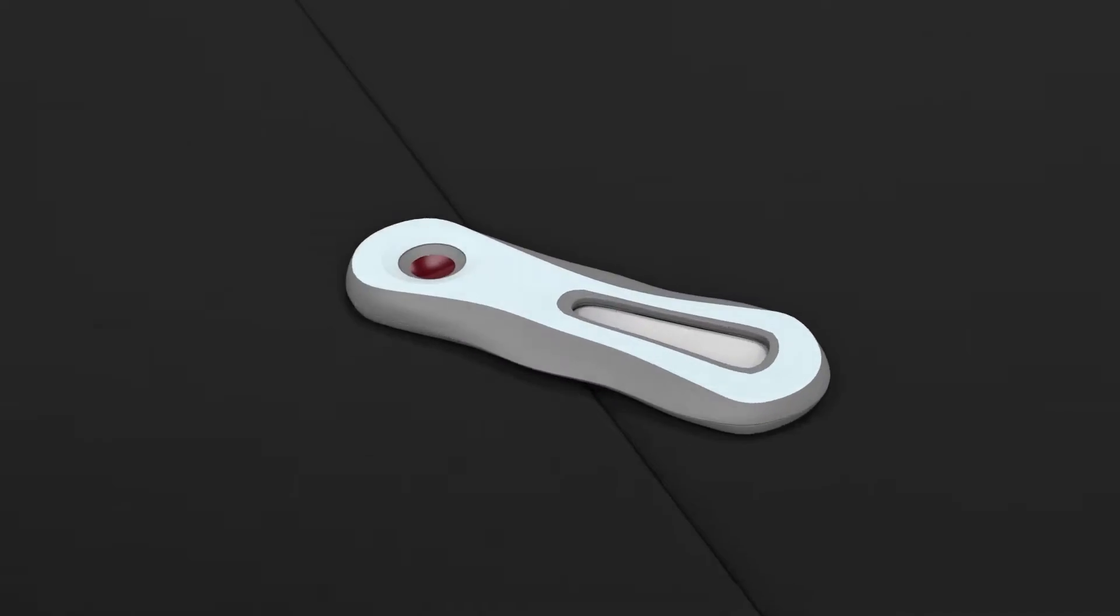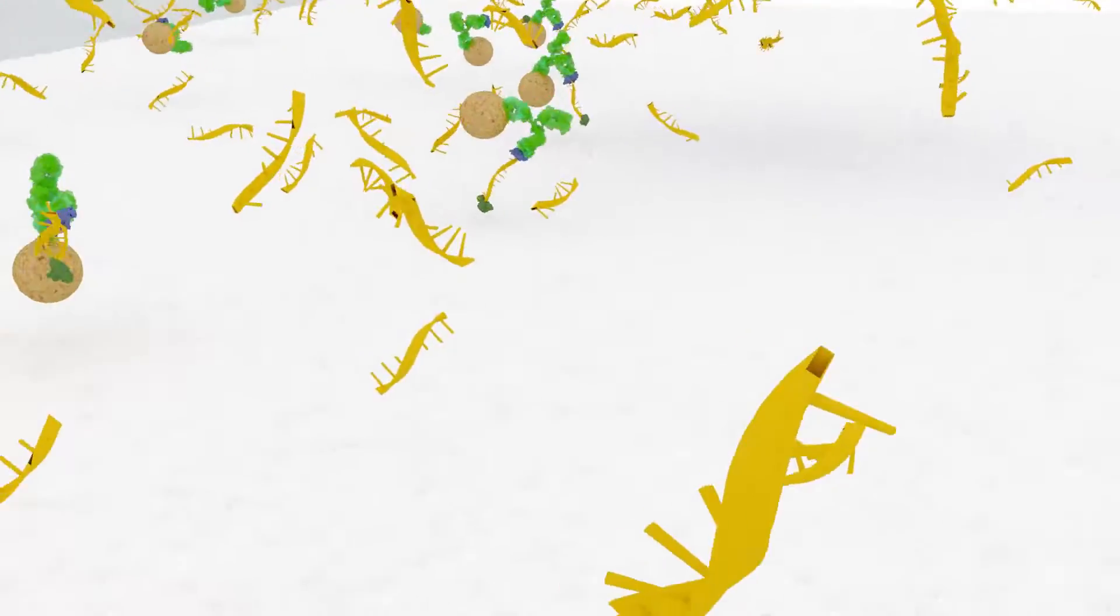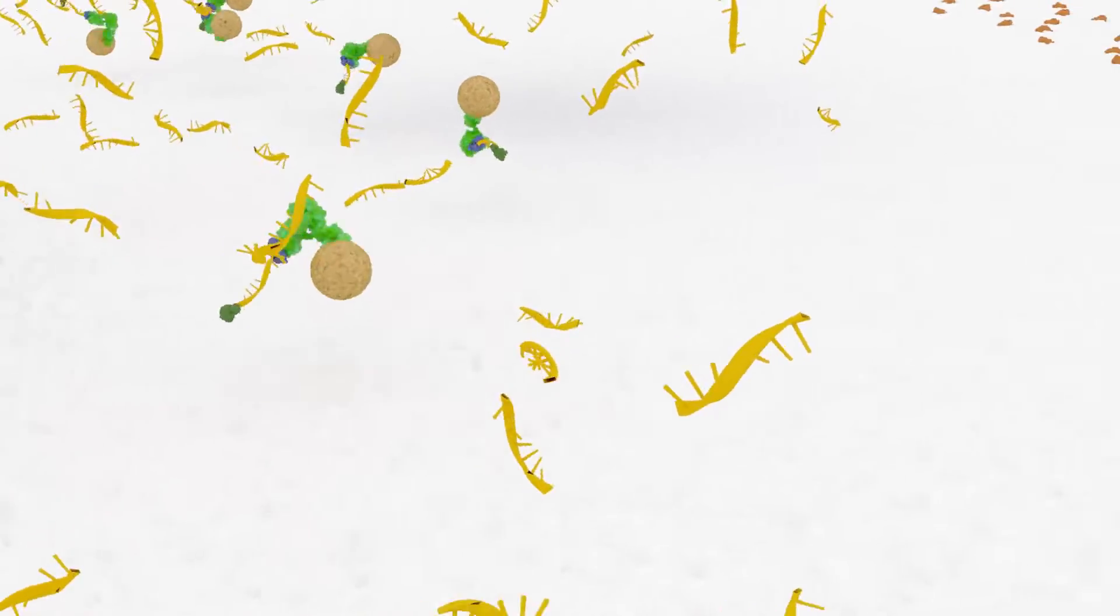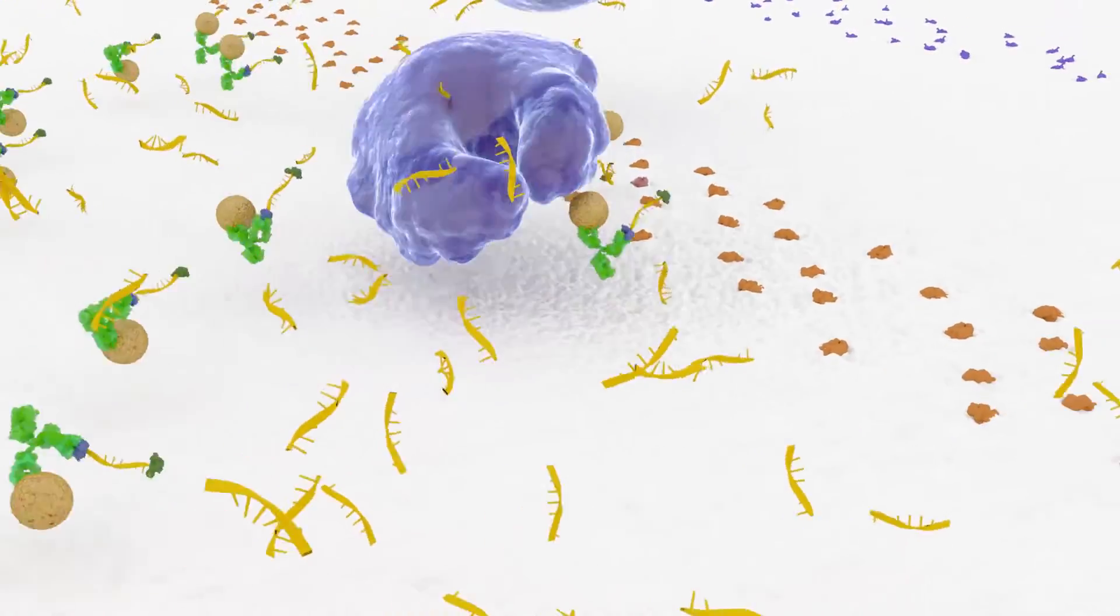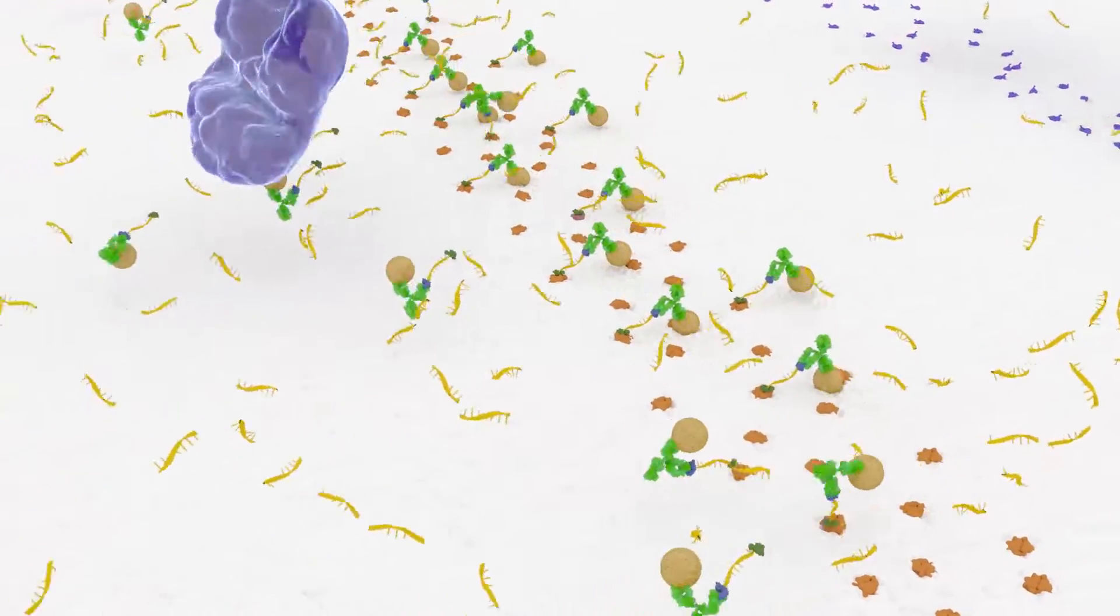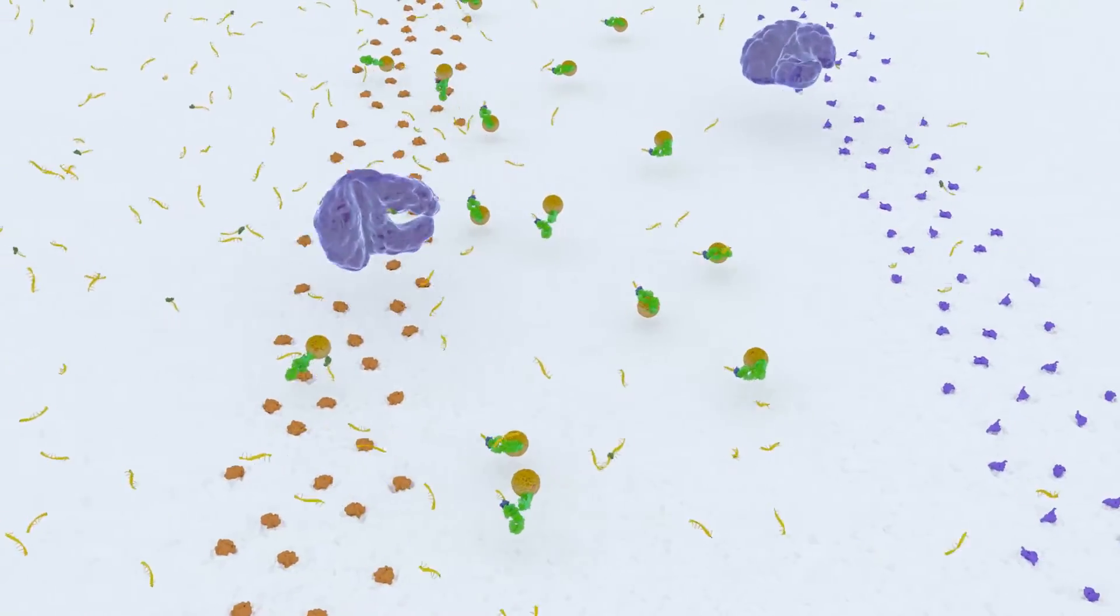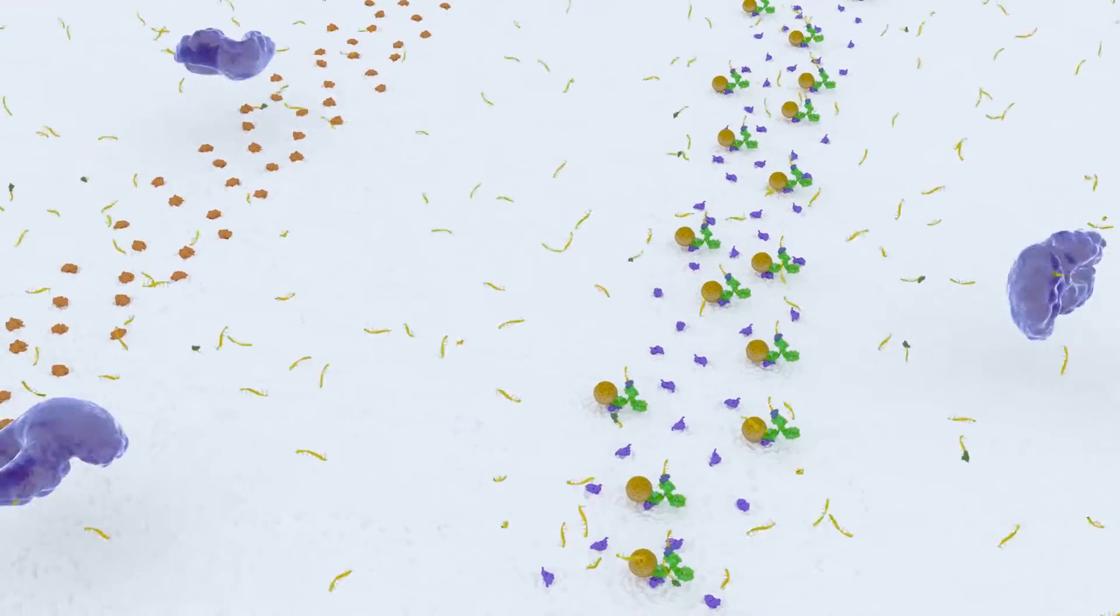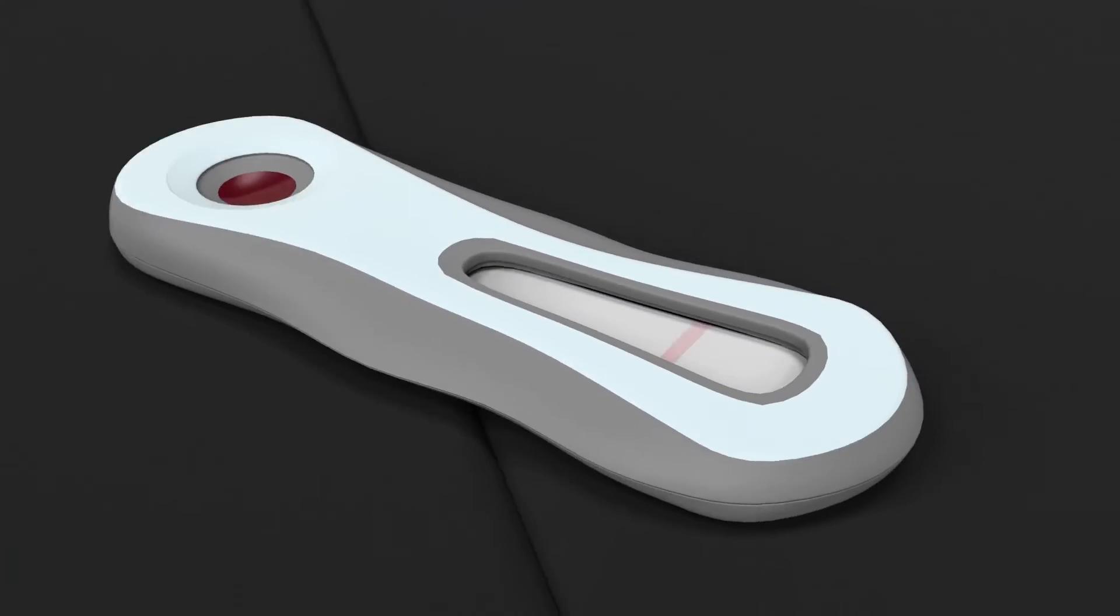The sample is then applied to a commercial flow detection system. If the sample is negative for flu, the reporter remains intact and collects at the first detection line. If the sample is positive for flu, it collects at a different location, making a diagnosis easy to spot.